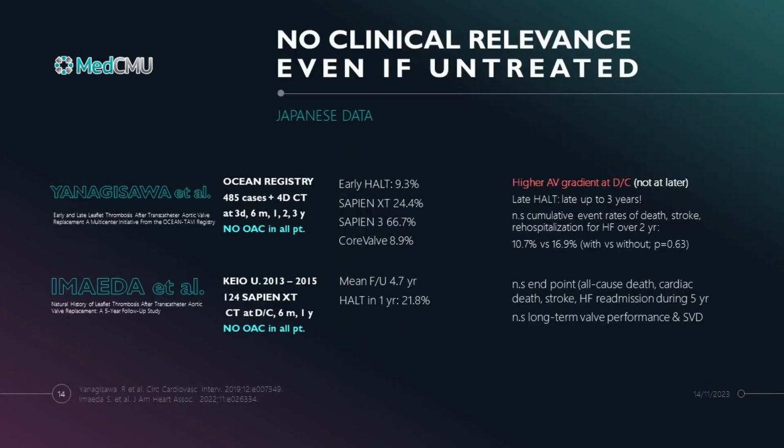Vice versa, there are some studies that show that HALT has no clinical relevance. For example, these 2 studies come from Japan. The first study used the OCEAN registry data, and they performed a CT scan after TAVR without any oral anticoagulation in all patients. The HALT occurred in 9.3%.